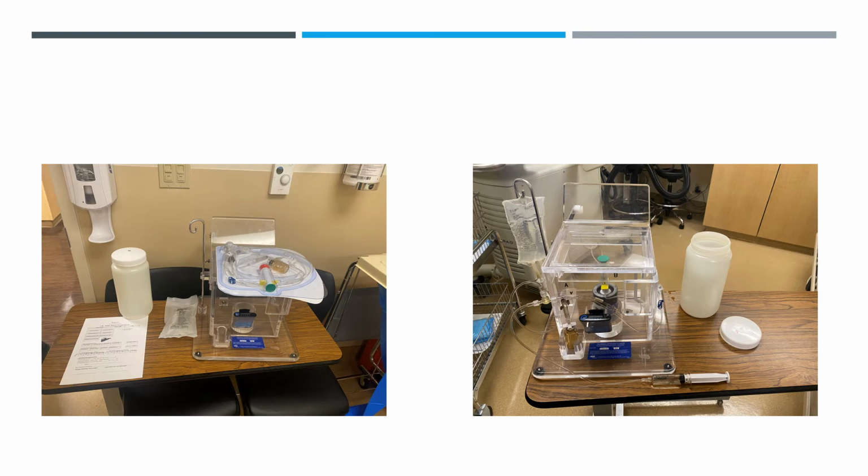I hope I can. Hold on. Okay, well, I guess I could just tell you guys what the other slide said. So basically, our job as a nuclear medicine technologist during these Theraspheres is to set up this device, set up the dose for the interventional radiologist.